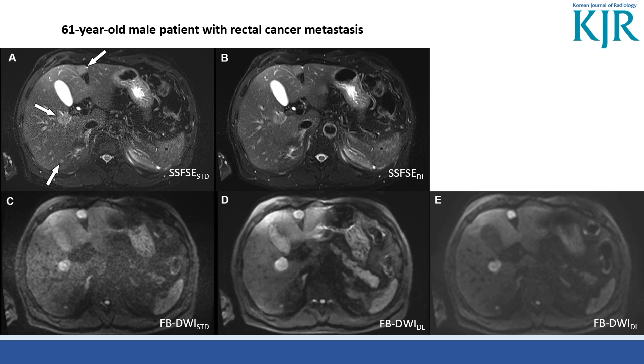In this 61-year-old male patient with rectal cancer metastasis, 3 metastatic lesions of varying sizes are clearly visualized in both the standard and deep learning accelerated sequences. Reduced noise and artifacts are evident in deep learning T2 and diffusion-weighted imaging compared to the standard protocols.